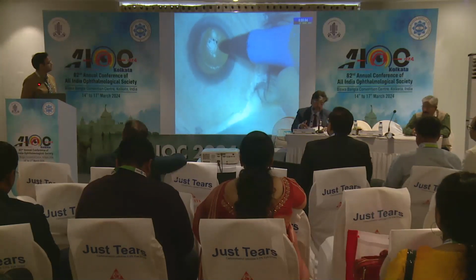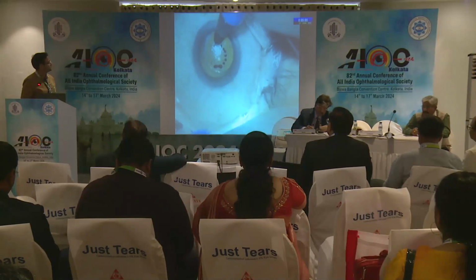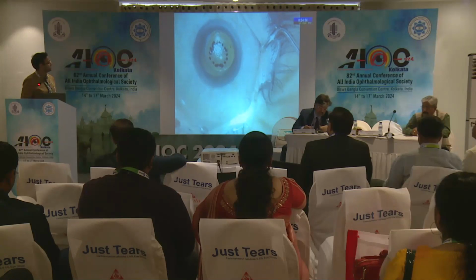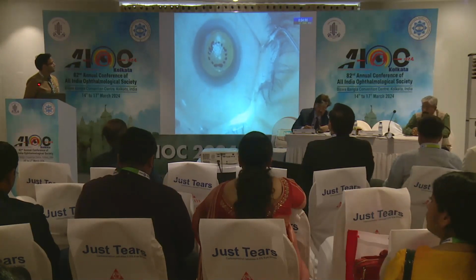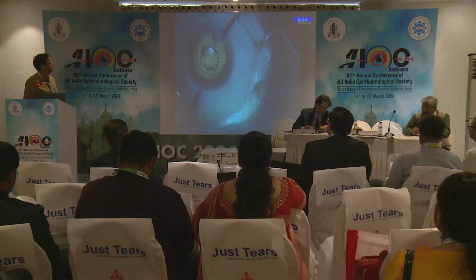it is always a good idea to mark your rhexis clearly so as not to exceed the rhexis size, because the rhexis size is very important here. You have to keep it within the limits of 4 mm. A larger rhexis has delayed healing or maybe no healing at all.